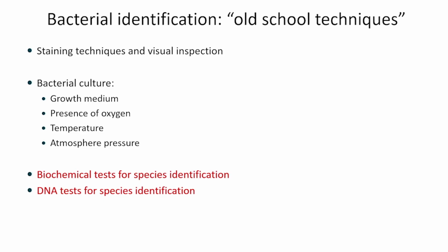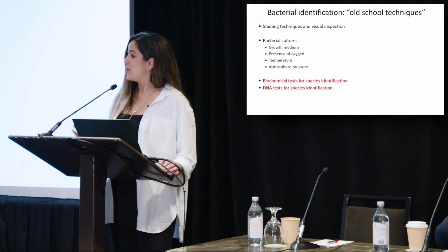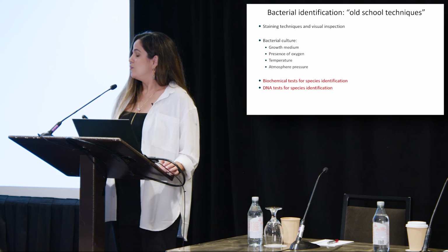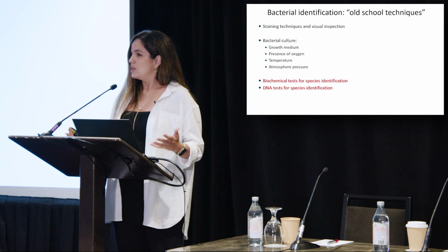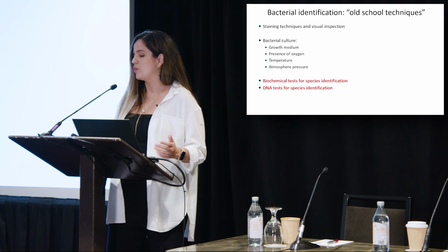So basically, we have one goal in the clinical lab, and one goal only: isolate and identify microbes. We want to know if these microbes are disruptors of your small bowel microbiome or fecal microbiome or any microbiome that we are studying. And there is only one way to do that: by isolating them and identifying them with specific techniques that can be a biochemical test, a protein analysis, or DNA sequencing, it doesn't matter. We need to identify this specific pathogen, right? And then, because of that, we can release the report and understand better how these microbes are interacting with your normal flora, with your microbiome.